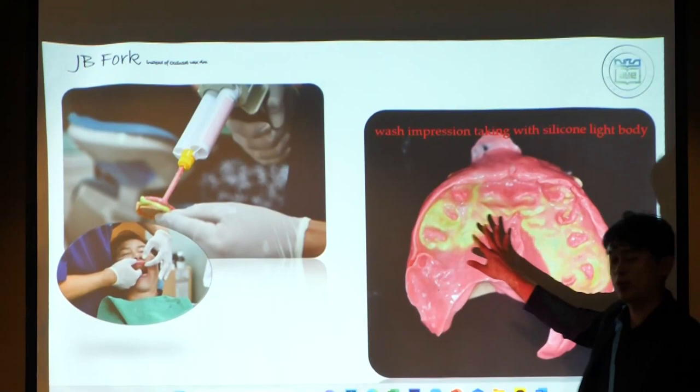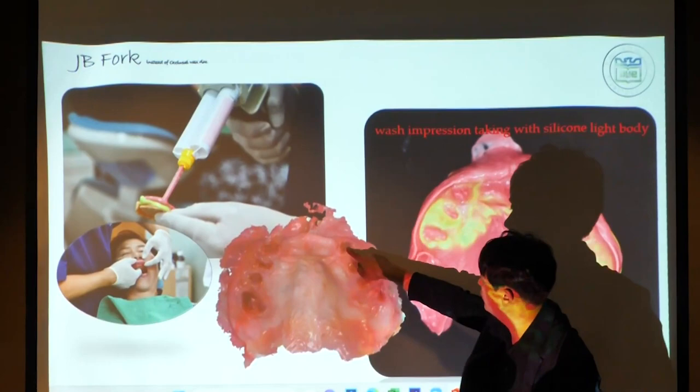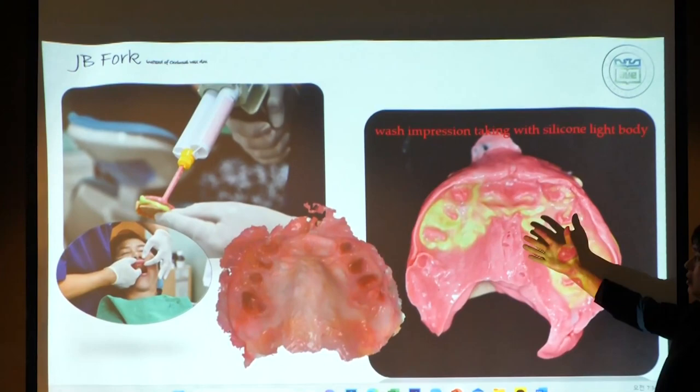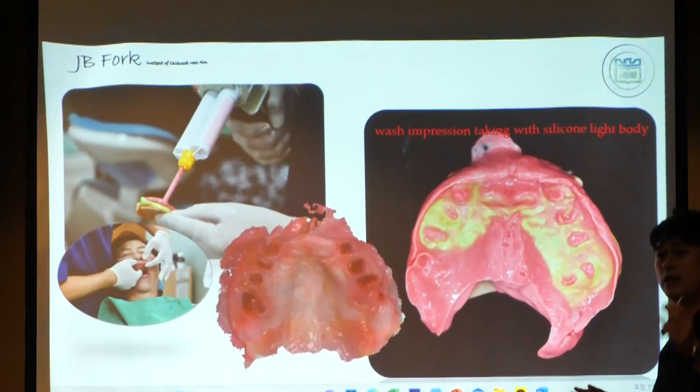So this is the upper impression. You have to merge together. This point is the same as this point. This point is the same as this point. Okay? This is the negative impression surface, and this is the positive surface. So we have to merge together. But this step will be proceeded by the dental technician, don't worry.